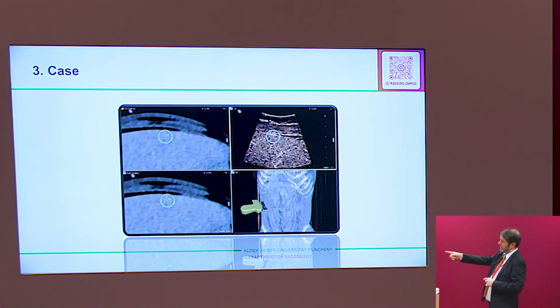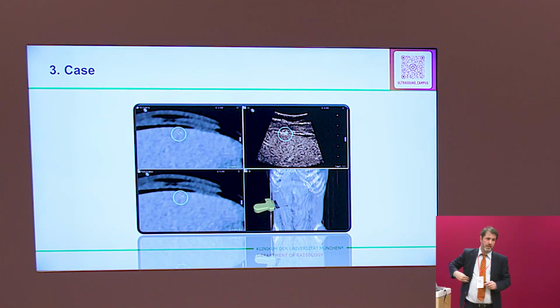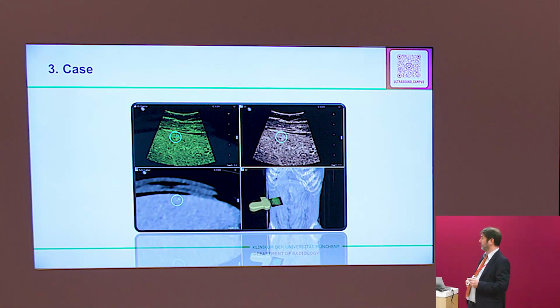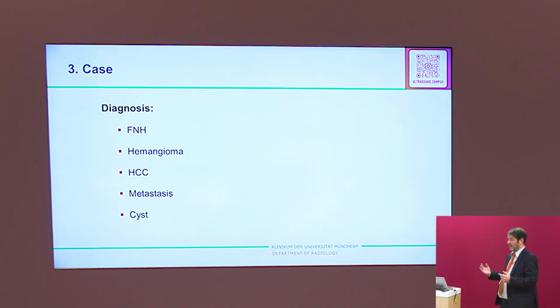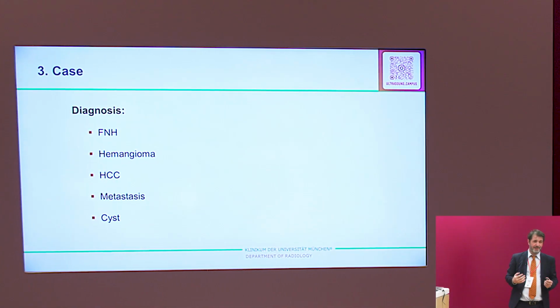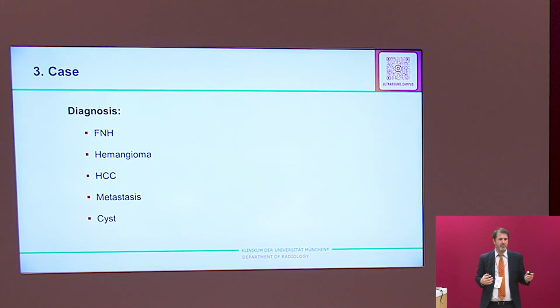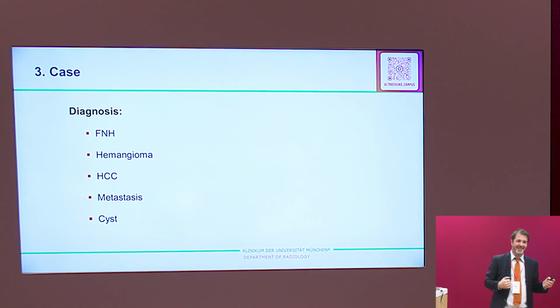And you also see here how I hold the probe for doing this examination. Now, of course, you are a bioengineering student, correct? Biomedical. So you have less experience regarding pathologies. Okay.